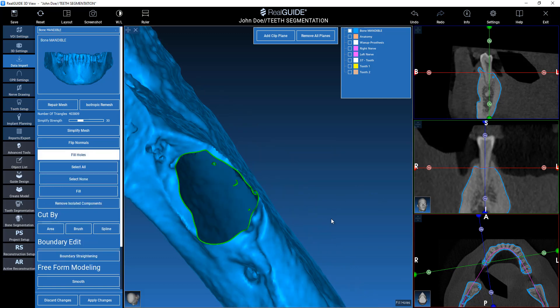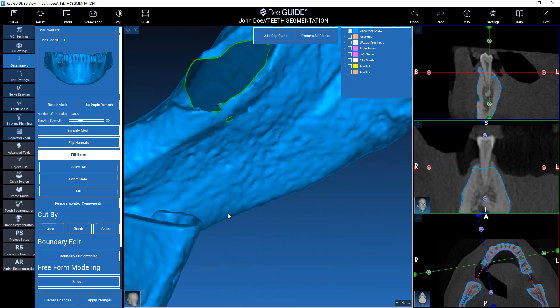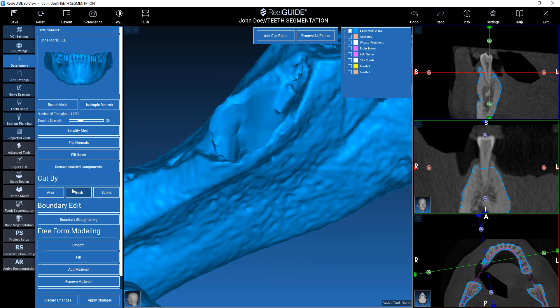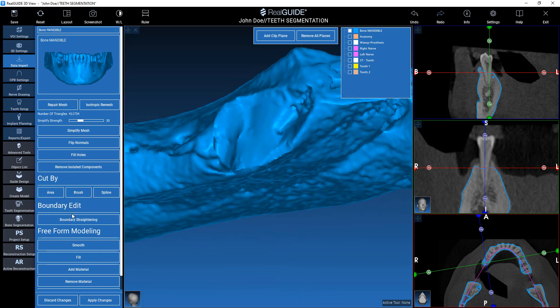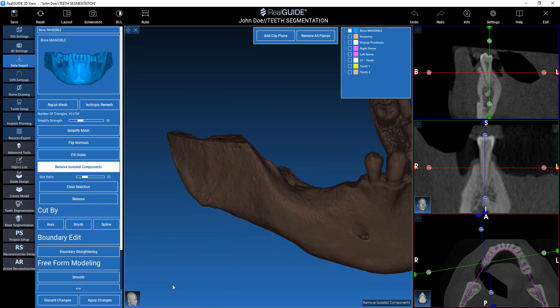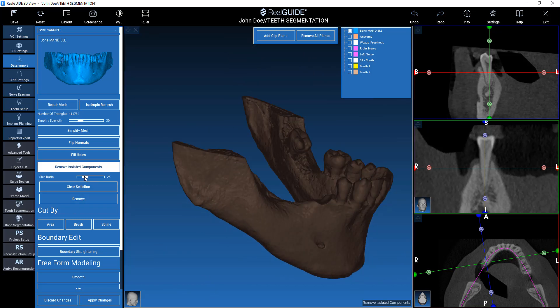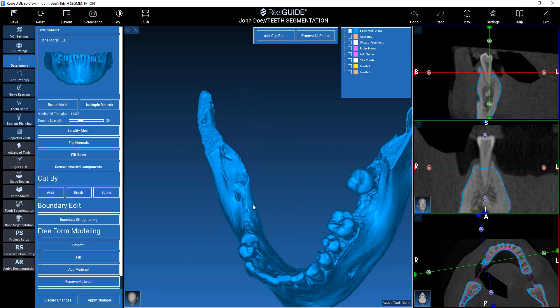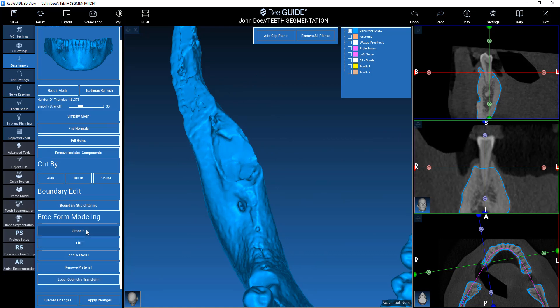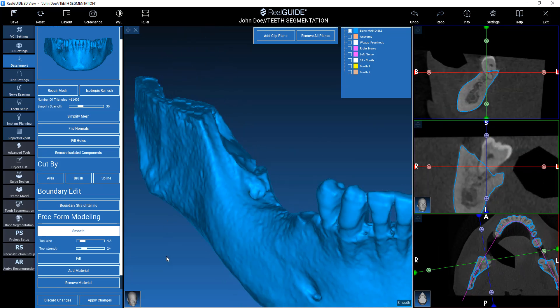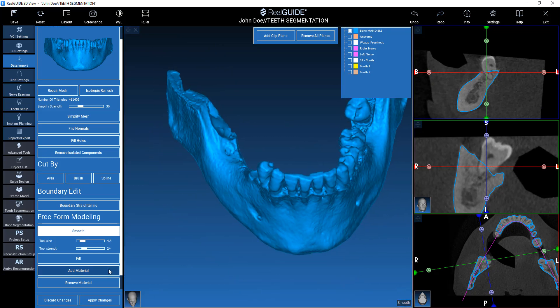Fill holes. If you have some isolated components, you can remove them. If I have this selection, I remove just the small parts. Now I have my final volume — I can always fill and smooth, and now I have a good surface and a closed watertight file for any boolean operation.